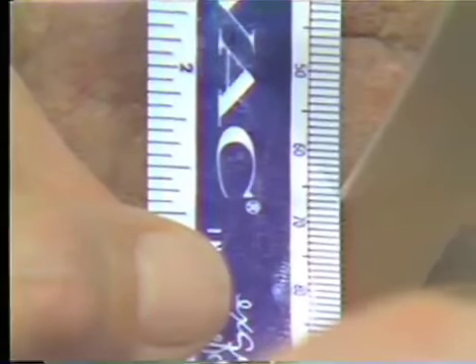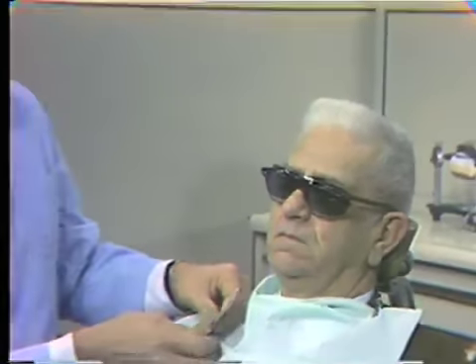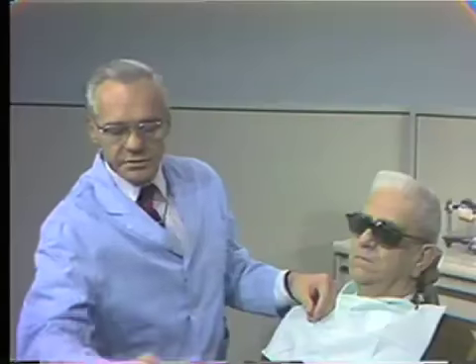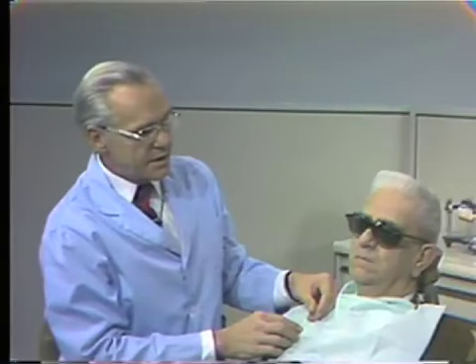So with the dentures he is now wearing, he has a freeway or interocclusal distance of approximately 2.5 to 3 millimeters. This is well within reason, and in the new dentures we will not attempt to make much change in this interocclusal distance. So our next step now is to have Mr. Monahan remove his dentures, and we will proceed to establish our dimension of occlusion with the bases that we have fabricated.